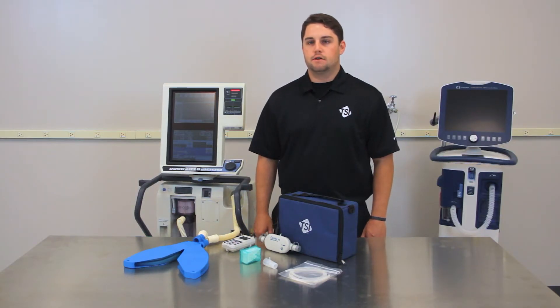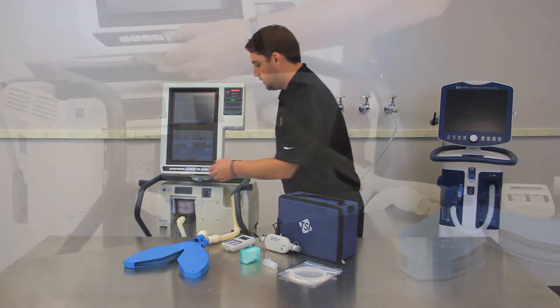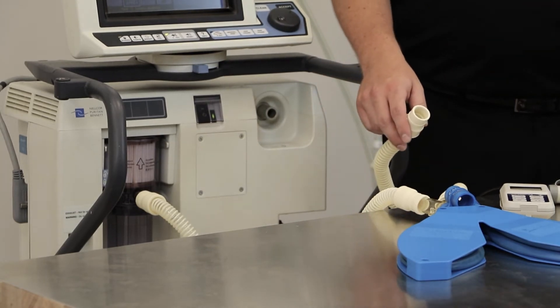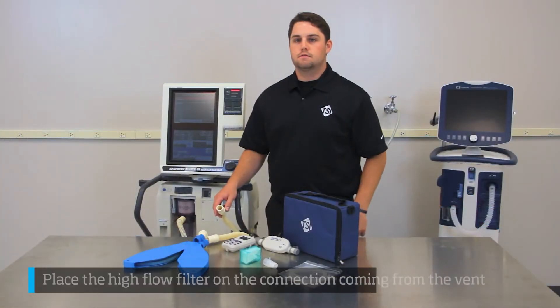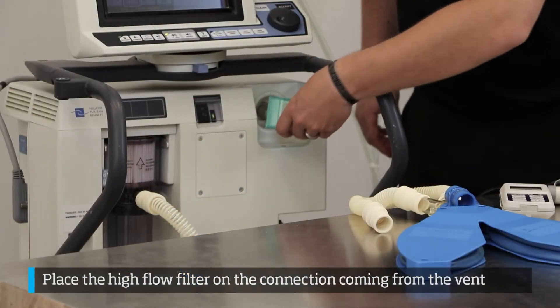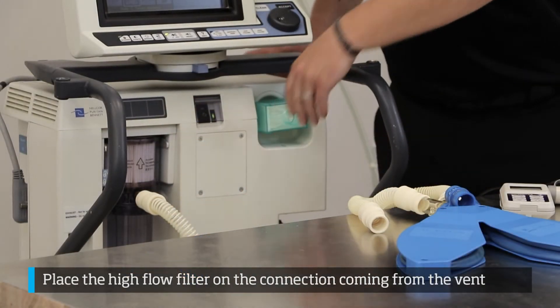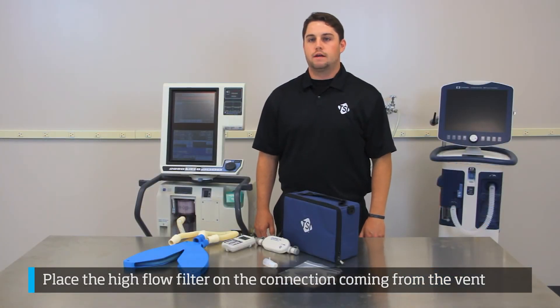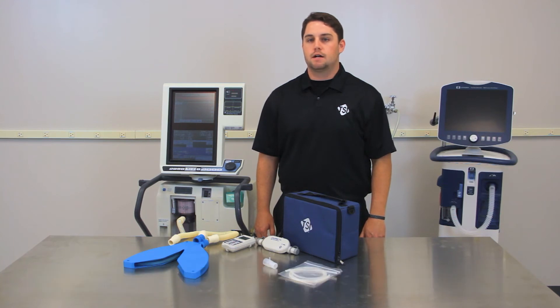Now that we have the necessary components ready, let's see how we connect this to our ventilator. The first step is to remove the tubing coming from the inspiratory side of the ventilator. Once that has been done, place the high flow filter on the connection coming from the vent, so the high flow filter is now in line with the airflow coming from the ventilator. This will prevent any debris from damaging the Certifier FA module.